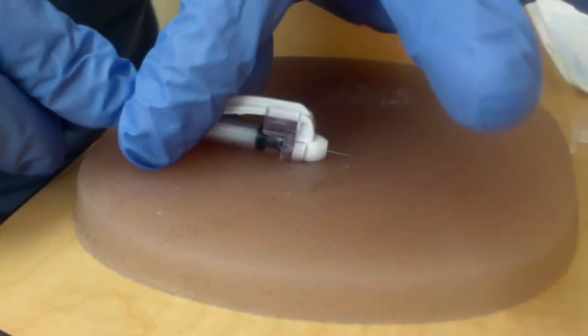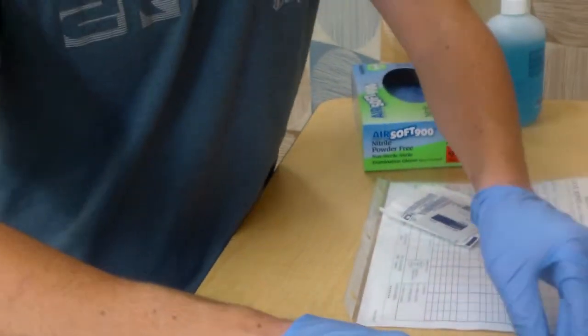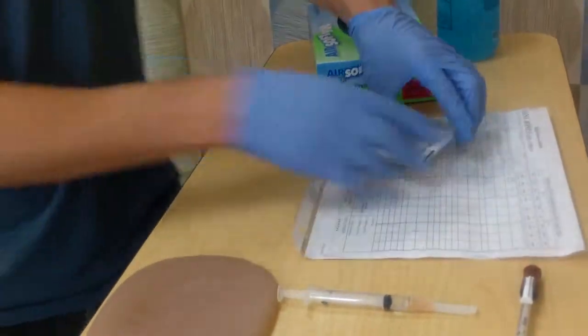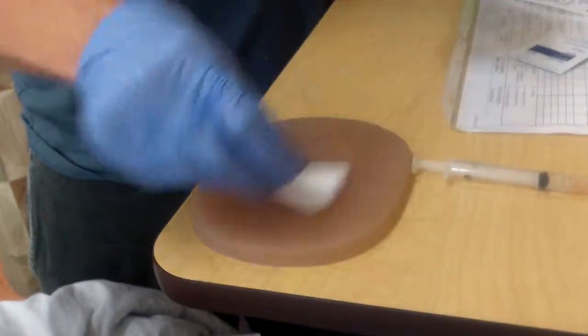So there's that, and I'm going to slide the needle out. Alright, so there should be a wheal form there. This is going to go in my sharps container right away, but I'm going to cap it. So then after that, if there's any other kind of medication that's seeping out, I would take my gauze and just kind of wipe that away, applying no pressure whatsoever.